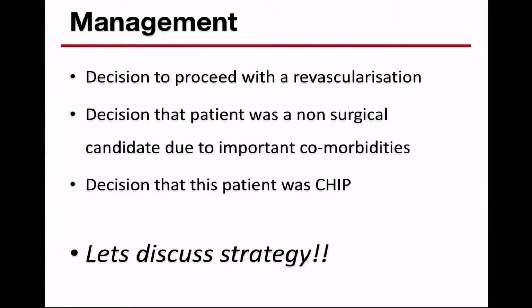So in terms of the management, since this was a team approach, a 2-man team, we try to do complex cases such as these as a 2-man operation. I'm going to hand this over to Mohamed to discuss strategy and the procedure.